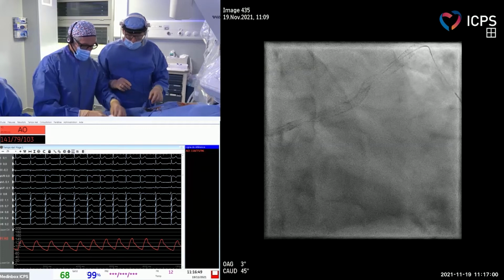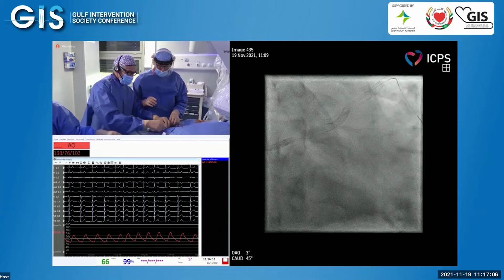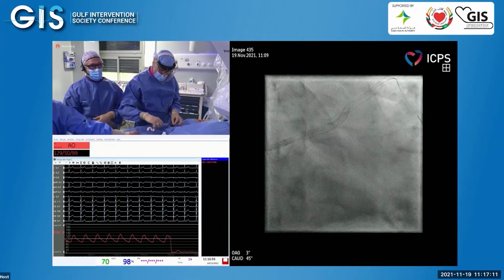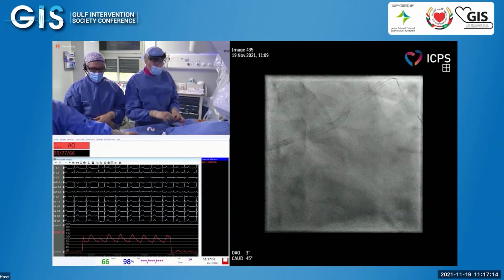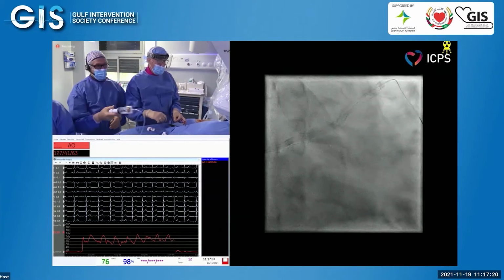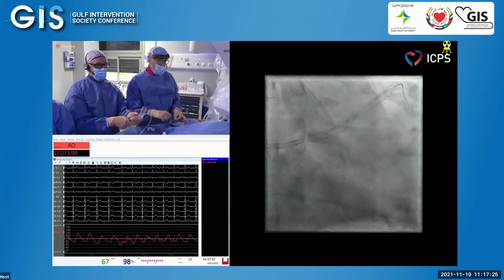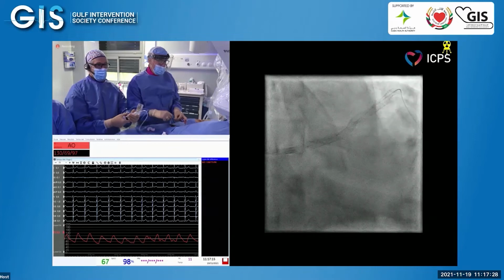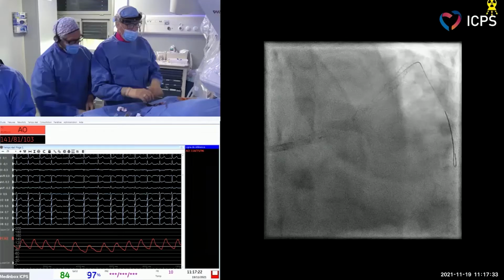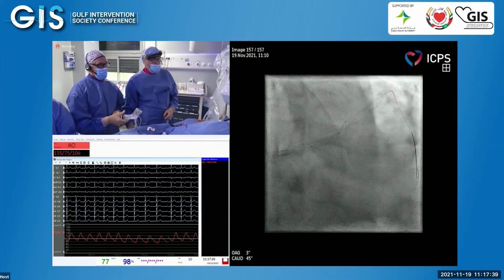easily in the stent. If I may just share my thoughts, when you have the proximal portion of the stent not expanded, because we want to do POT, I try to go with a compliant balloon for a couple of reasons. One, you could damage the stent going in with a bulky non-compliant balloon 5.5 or 6. So I use a compliant balloon to get in, and when you pull it back, it minimizes the risk of longitudinal stent deformation. I don't know what other thoughts the other panelists and my colleagues here have.